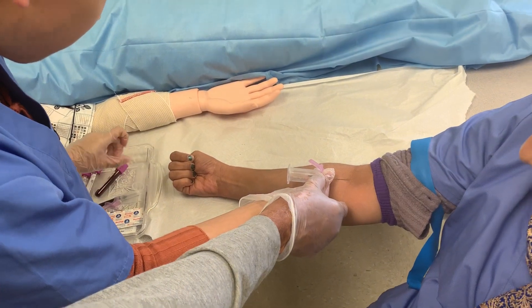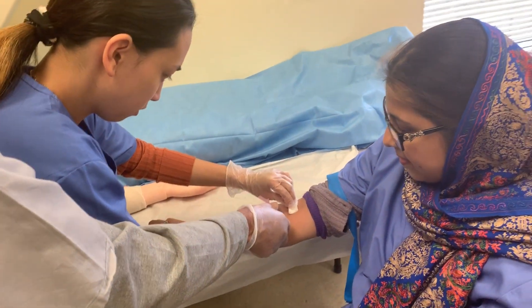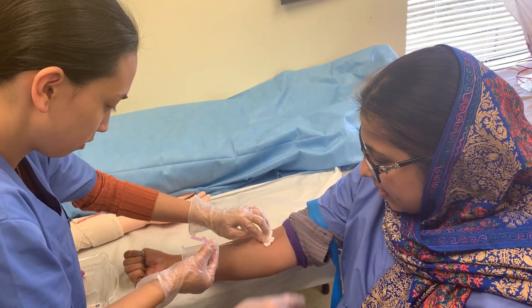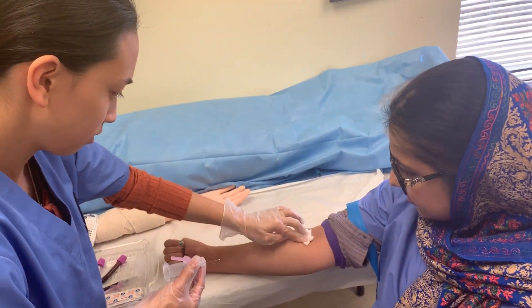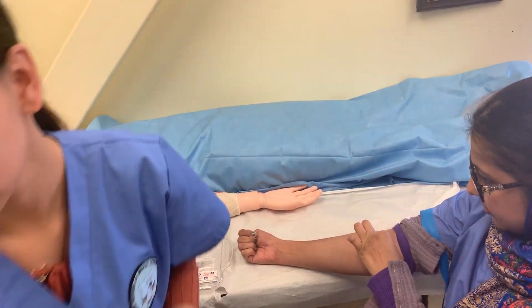Good, take the gauze. Yes. Ask her to press — activate safety, dispose of it. Good job. Thank you.